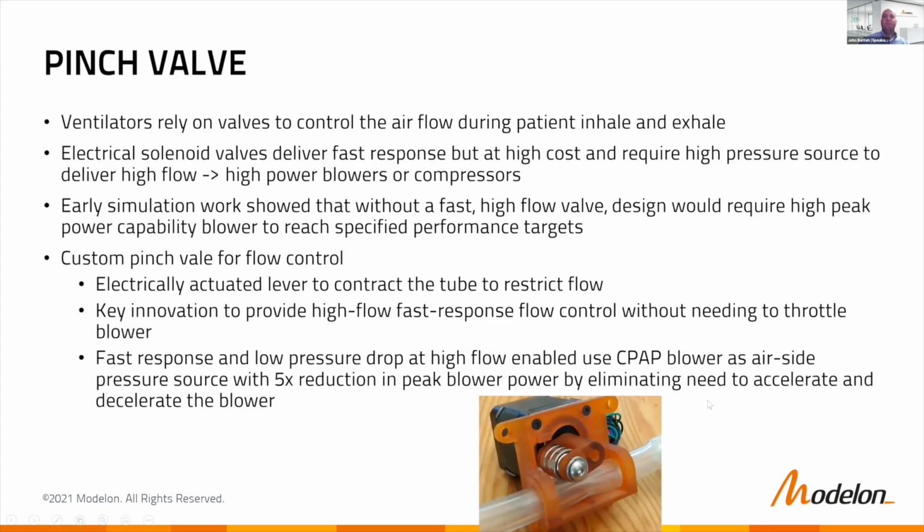The next key piece of the system was the valves. Ventilators rely on valves to control the airflow during patient inhale and exhale. Solenoid valves are great. They deliver fast response, but they're very costly and also require a higher pressure source to deliver high flow. And our early simulation work, which I'll show you in a few slides, shows that without a fast high flow valve, the design will require much higher peak power capability to reach the performance targets.